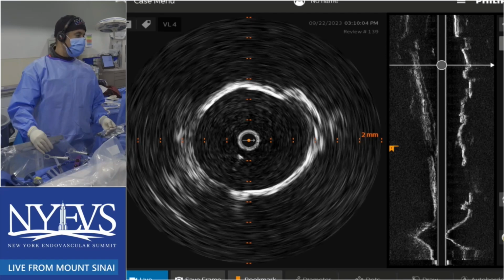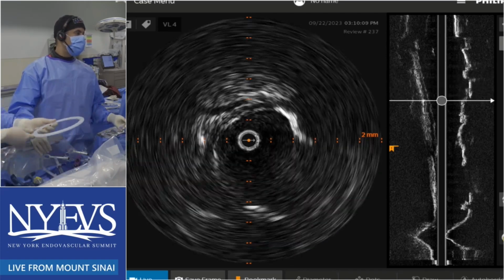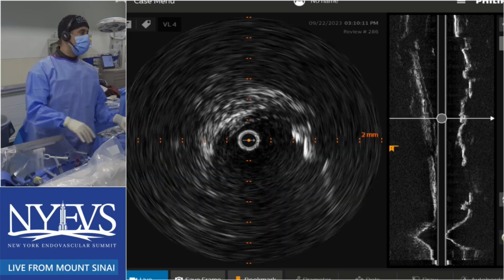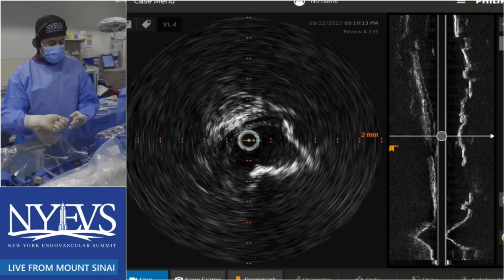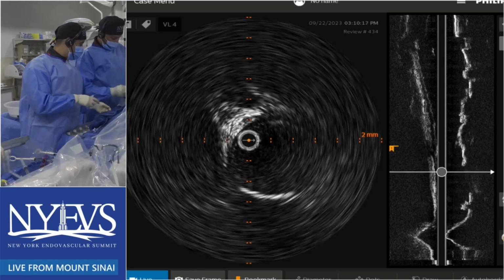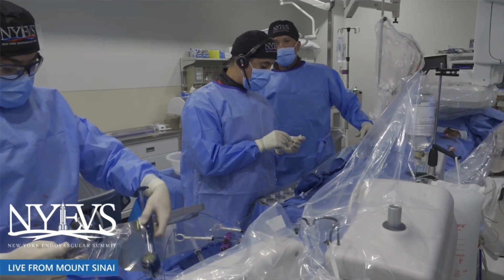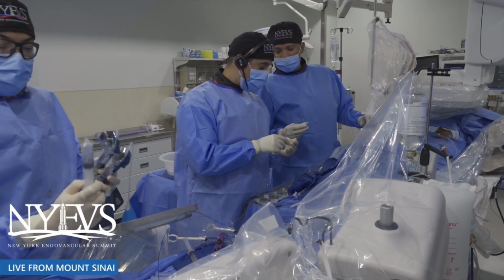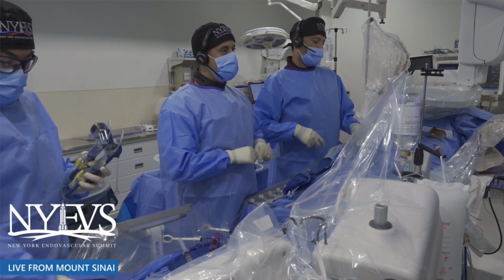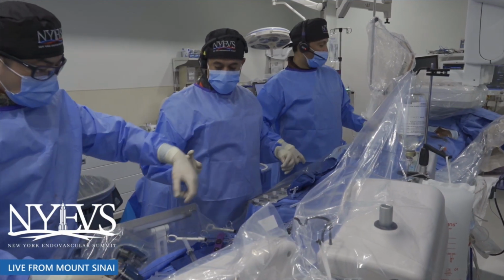So Darren, with the ICE study, in the comment, it was almost opposite to what you and I think, and that's why I worry. Are we putting a lot of weight on the appearance of it rather than the hemodynamics of it, and do we just sort of accept a suboptimal result as long as we have hemodynamic resolution? I mean, that's what the ICE study showed, that there was effectiveness of these self-expanding stents, and maybe more so.